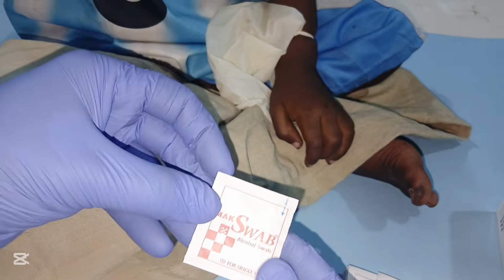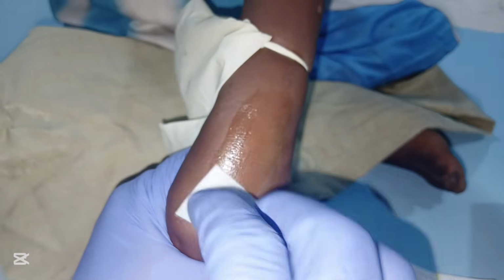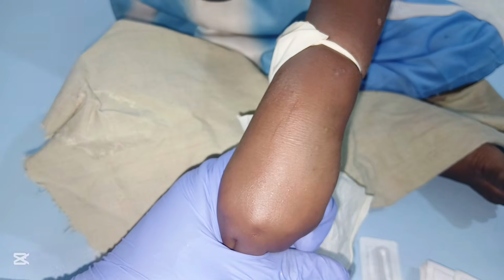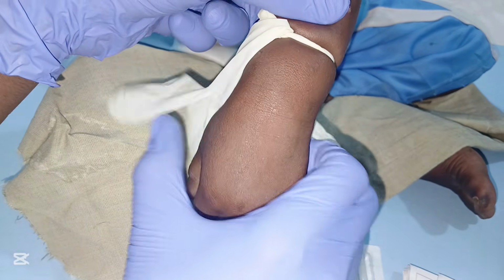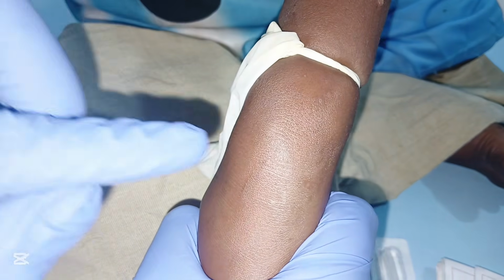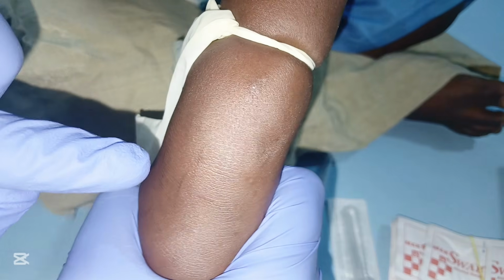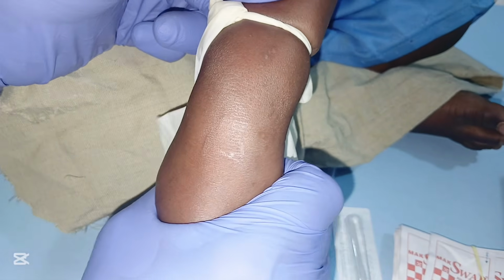First, make sure you get an alcohol swab. You clean the vein first with the alcohol swab. Then allow the skin to dry for some time. Another mistake you are supposed to avoid is inserting the IV cannula in an area where two veins meet. So you have to avoid inserting the IV cannula at an angle where two veins meet.